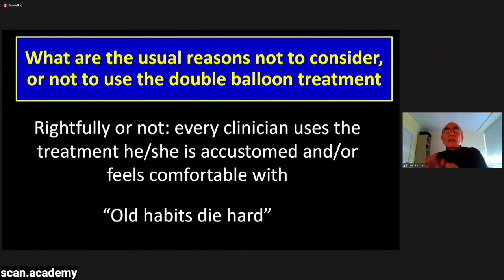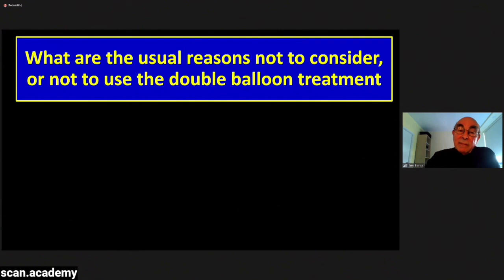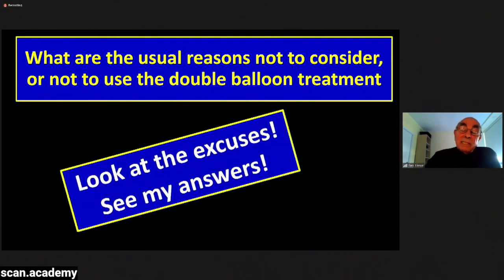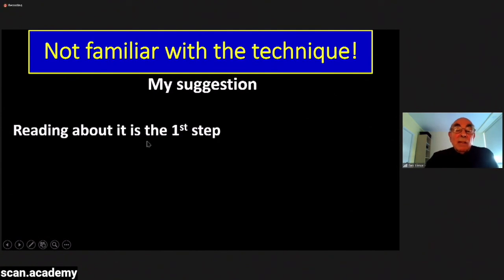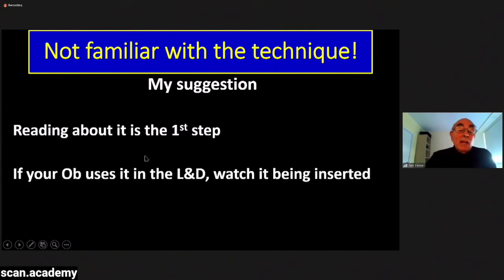So what are the usual reasons not to use the double balloon? Rightfully or not, every clinician uses the treatment he or she is accustomed to or feels comfortable with. Old habits die hard. Not too many people want to change their practice. So look at the excuses and see my answers, because I have an answer for almost everything. Not familiar with the technique. My suggestion, read about it. It's the first step. If your OB uses it in the labor and delivery, watch it being inserted.